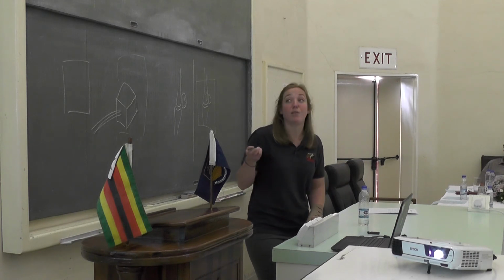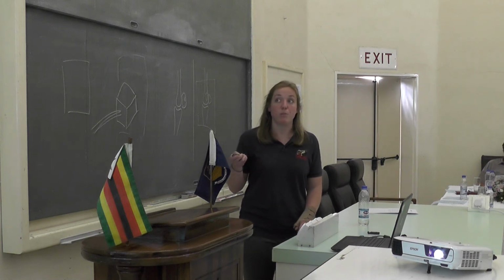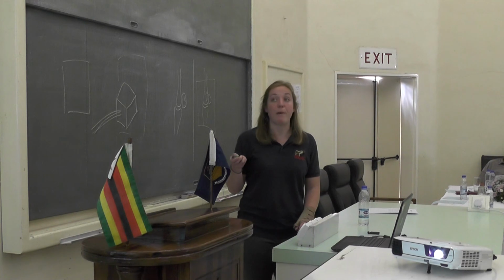And actually, do you know of a disease where we can use this as a measurement? Laminitis, does it ring a bell? Exactly. So in laminitis, we would look at rotation of P3, but we'd also look at the sinking of P3 within the hoof capsule, because in a normal horse it should roughly line up with the coronary band.